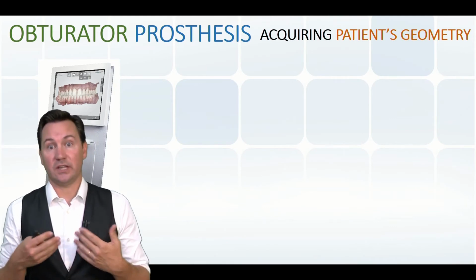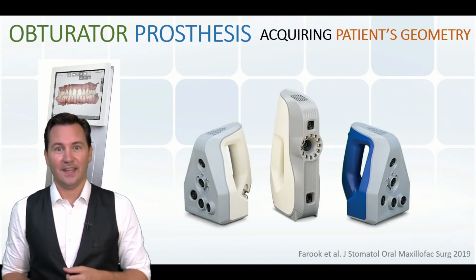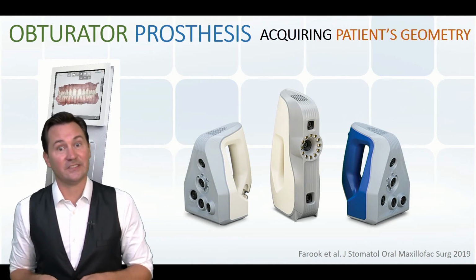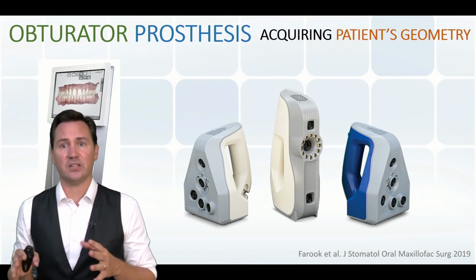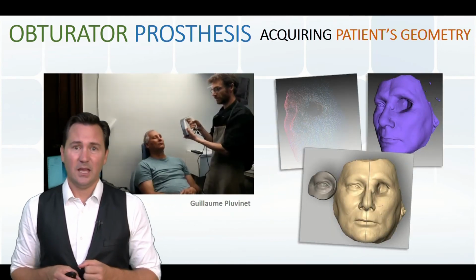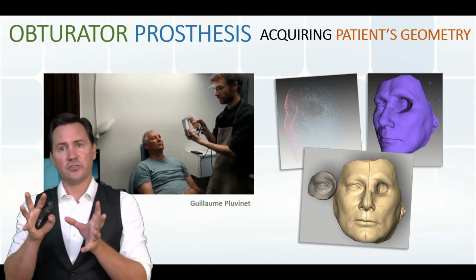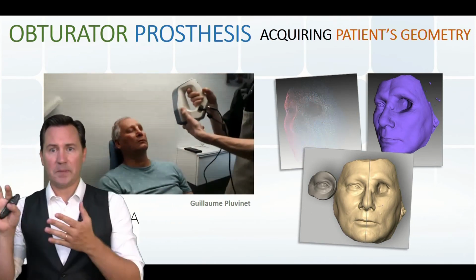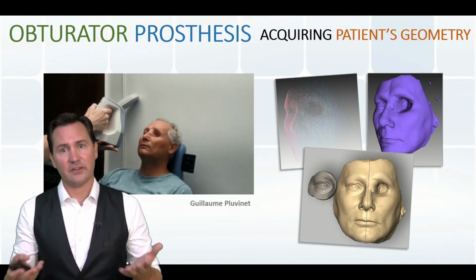But you can also get these files with an intraoral digital scanner that we know. You can also use extraoral scanners that are very interesting for maxillofacial prostheses, for ear, nose, and orbital reconstruction, because the mechanism is very similar to intraoral scanners. Here's an example of an extraoral impression. So you get a cloud of points recorded, a mesh is created, and then the technician can copy-paste the healthy side to the defect side just by playing with the mirror effect.